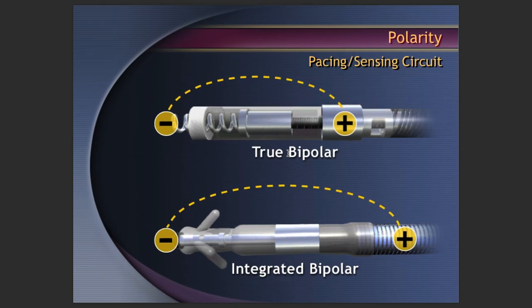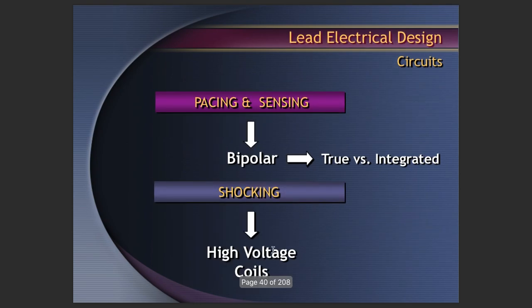So this also has slight importance. Why? Because whenever any kind of tip is being used in the ICD, it may be slightly variable in terms of design, the screwing leads, those tentacles over here, which you can see in the integrated bipolar leads.